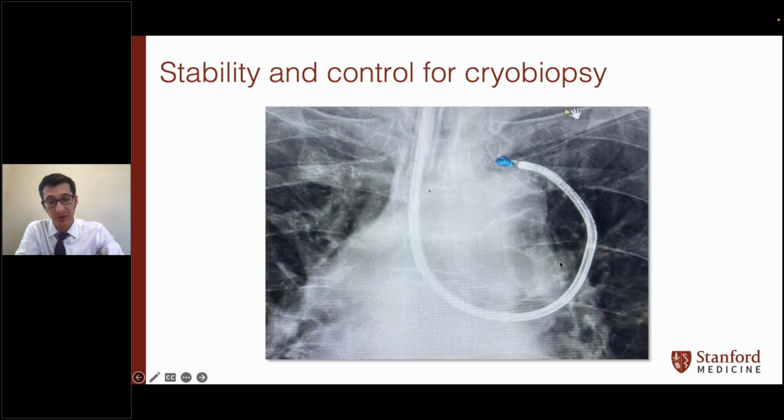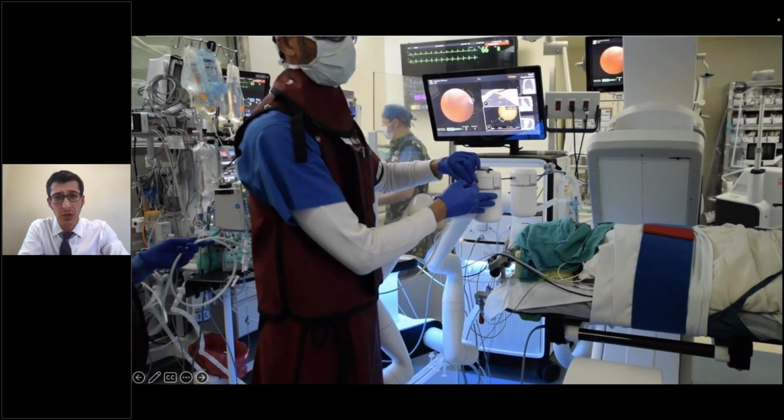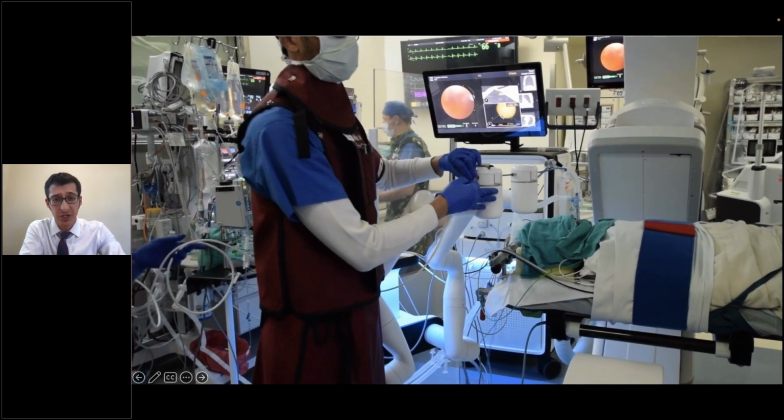And when you go out there with your regular flexible bronchoscope, before we had a robot and we had a balloon blocker, we were removing everything en bloc. Having to navigate back up to this target again would have been a real pain. This is from a different case, but it just shows you what the contrasting situation is with a robot.